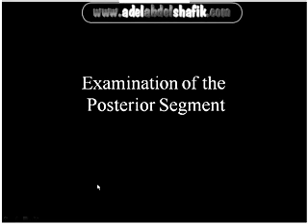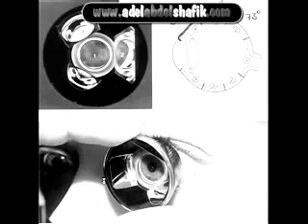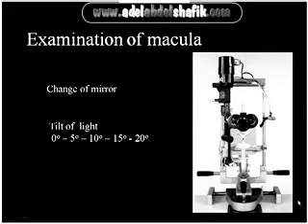This is the regular mirror. If it's end-on with the microscope, you don't see the light itself. But if you change this regular mirror and put the short mirror as here, you can get the light end-on and you get your line of vision visible, and you can still see the posterior segment.